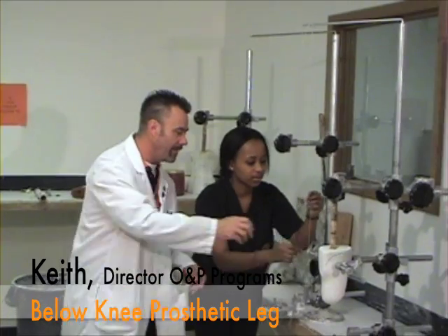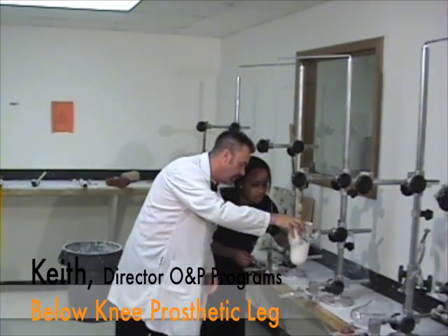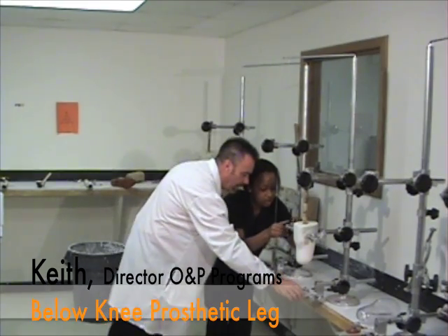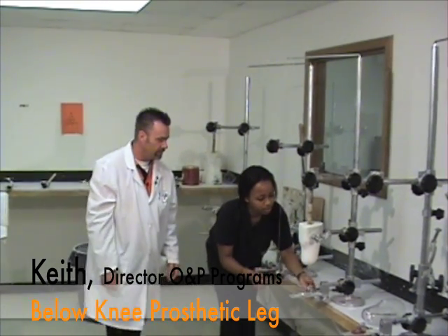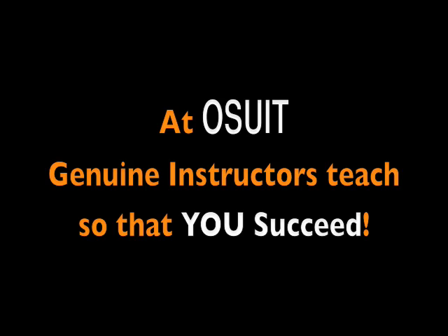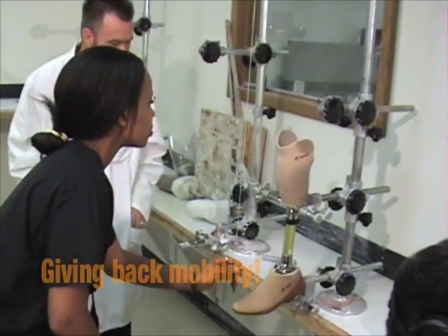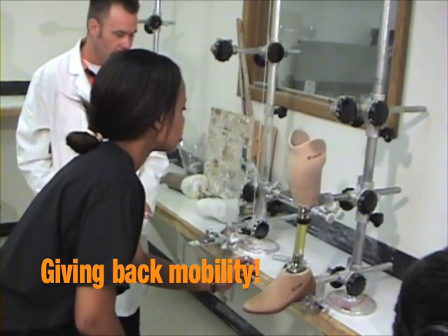Very good. Be sure that we have enough flexion and get a positive in relation to your ankle.